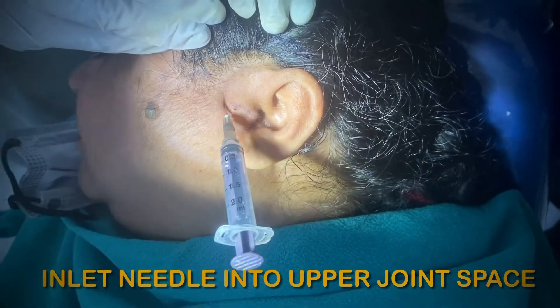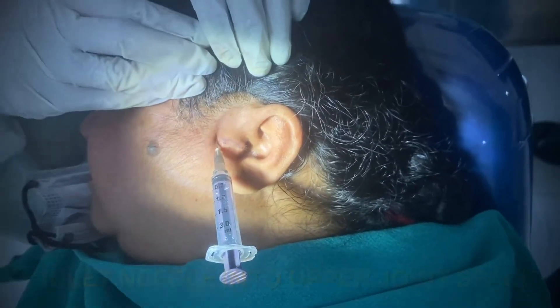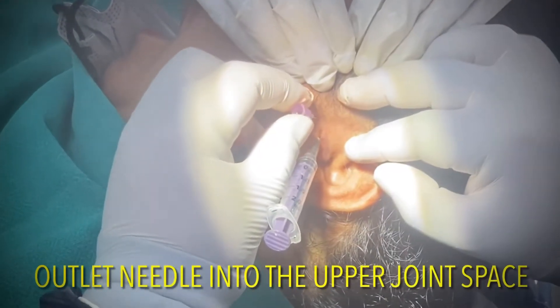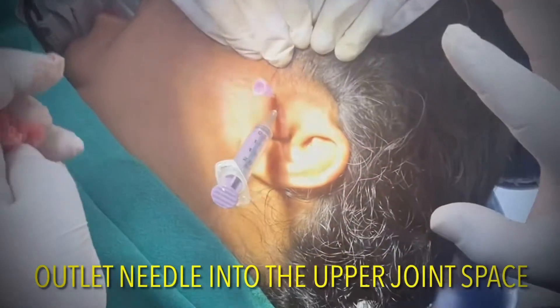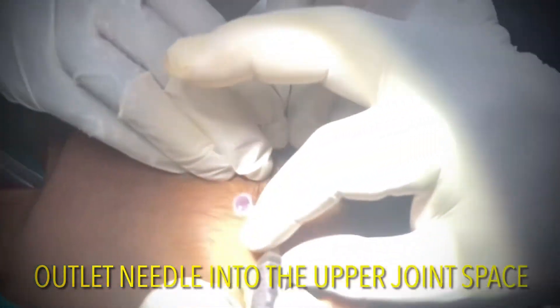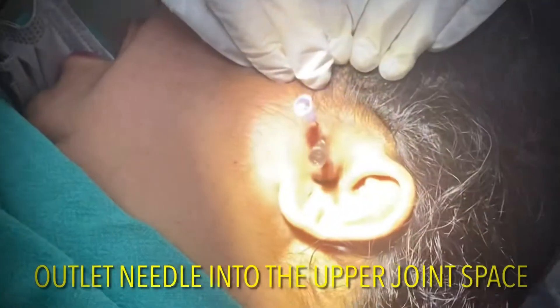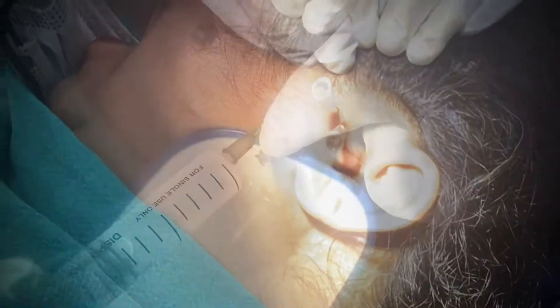In this procedure two sterile needles are placed inside the joint cavity and a sterile fluid is used to wash out the joint and make it free of the inflammatory mediators. These are the chemicals which are basically playing a very major role in the regulation of pain in our body.